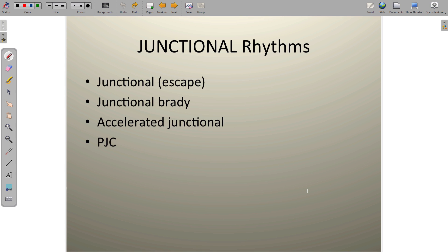Welcome back, everyone. Let's take a look at the junctional rhythms. We're going to cover the basic junctional rhythm and junctional escape rhythm, junctional bradycardia, accelerated junctional rhythm, and also the premature junctional complex, which is not a rhythm but something superimposed on a rhythm.